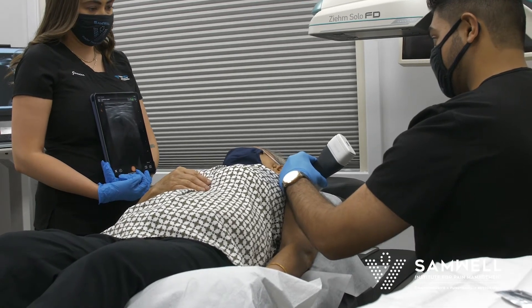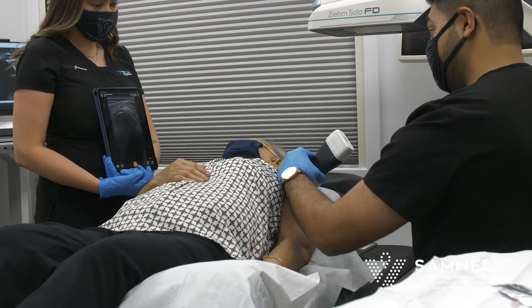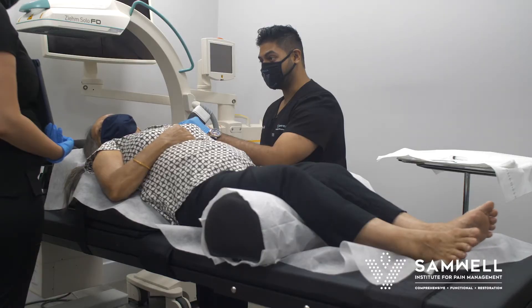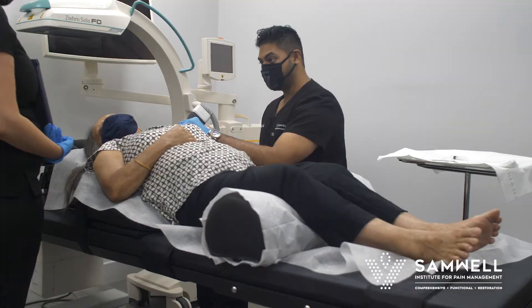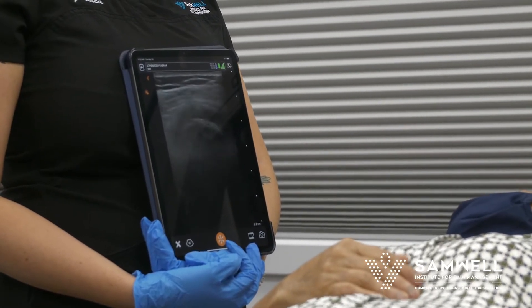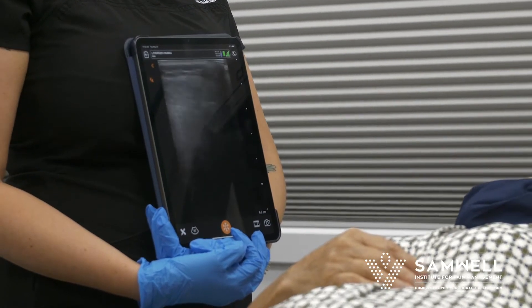So that's your rotator cuff right there. There's quite a bit of tendinitis in that shoulder. In the rotator cuff you have some calcifications. I can even see the small tear that you also have within the actual rotator cuff.